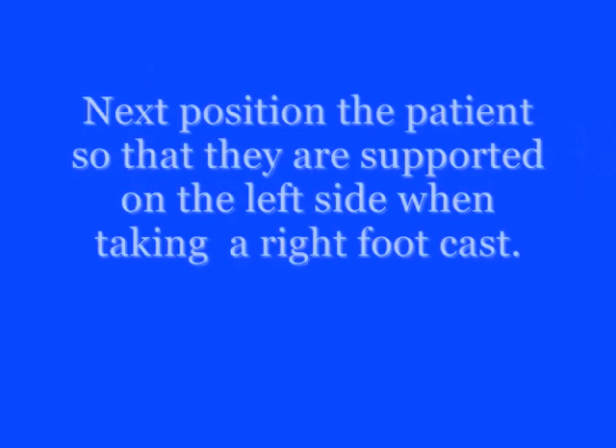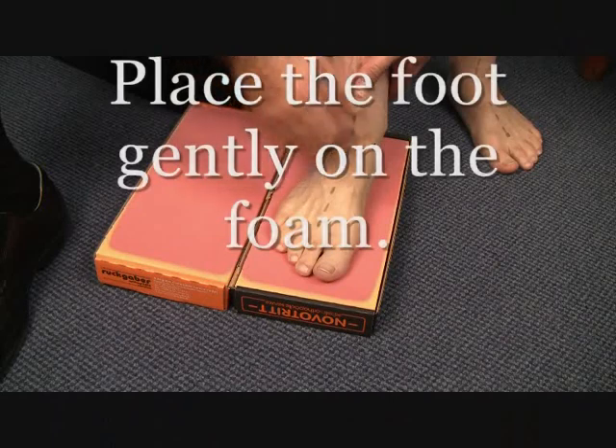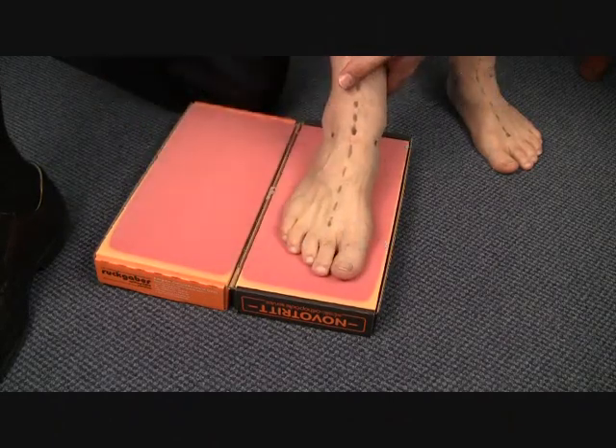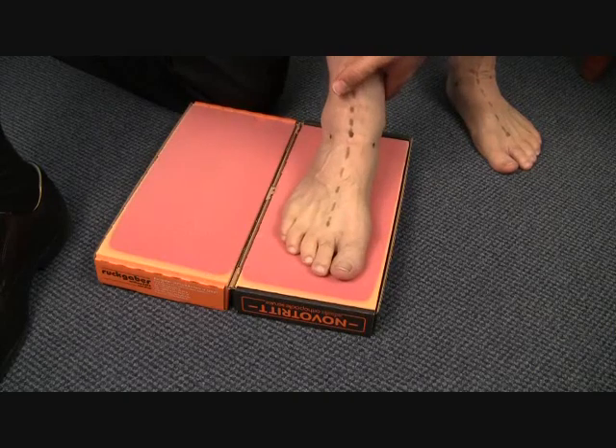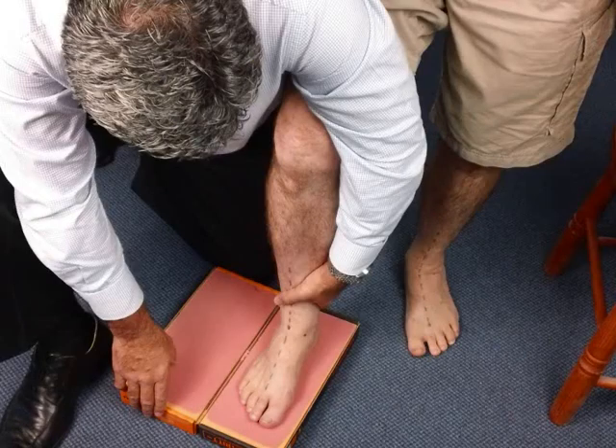To commence the casting procedure, position the patient so they are supported on the left hand side when taking a right foot cast. Rest the patient's foot gently on the foam. Do not allow them to depress their foot into the foam.